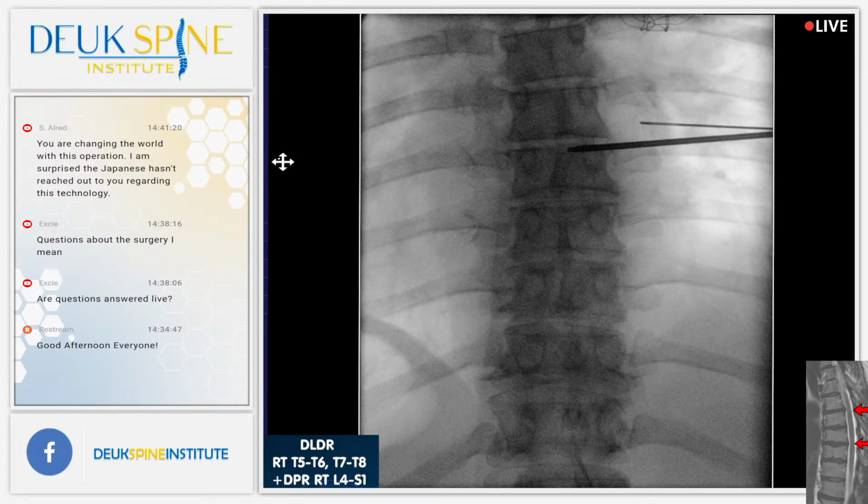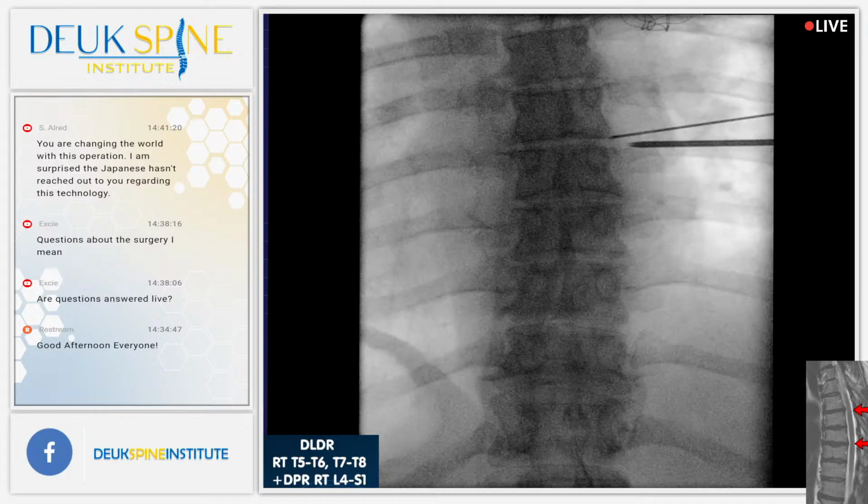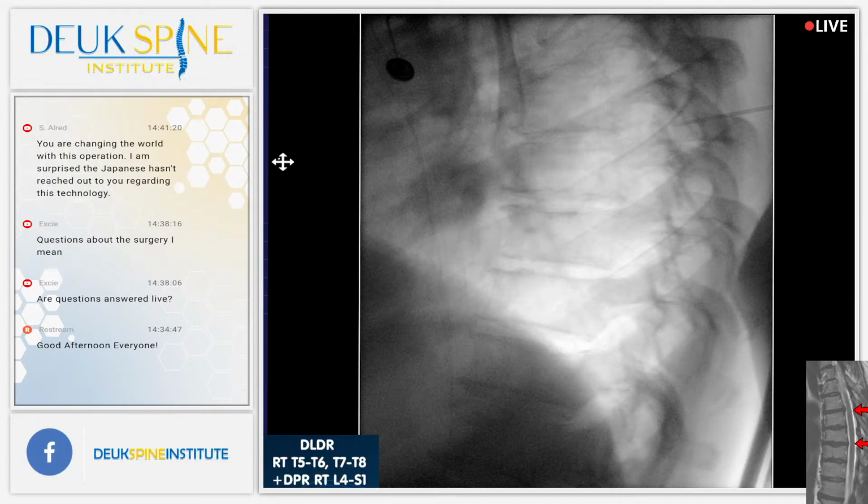Okay. Shot. All right, so I need to go a little further south. Where do you feel that? Let's go with a lateral view. Where do you feel that in your upper back? All right, I'll give you some numbing medicine. Let's give her some numbing medicine. Let me get a lateral shot. No, let me do it. Just giving you a little numbing medicine, that's all. You doing all right?